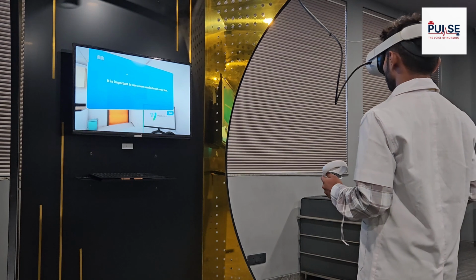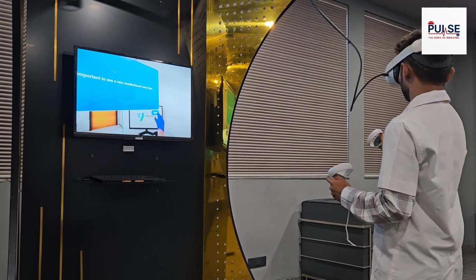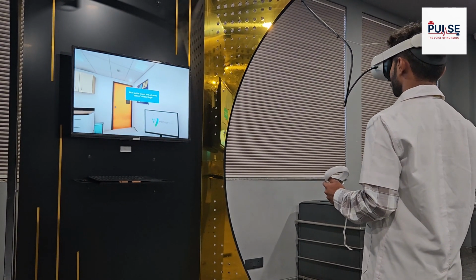Pick up the lancet and prick the patient's index finger.